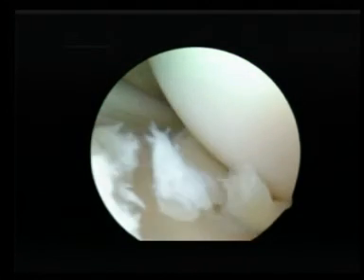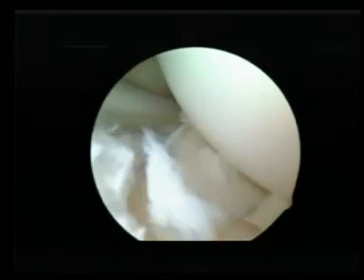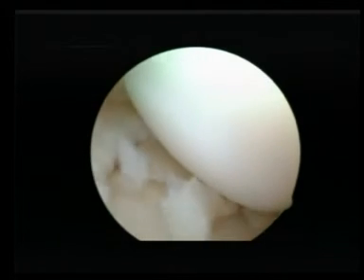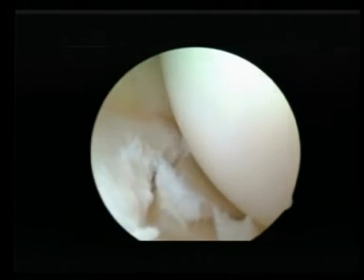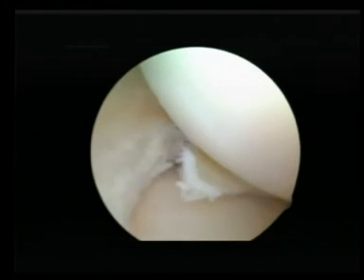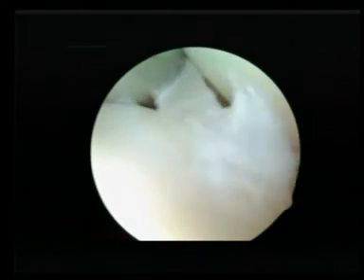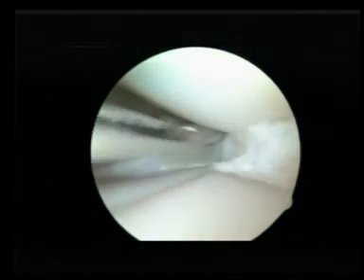This, if done appropriately, you can end up with a good balanced meniscus rather than taking the duckbill and going in at 90 degrees and chopping the meniscus off in bits and pieces, leaving a lot of dog ears. So you suck and remove all the debris, then you put a grasper and you can literally turn the rest of the meniscus and take it out.